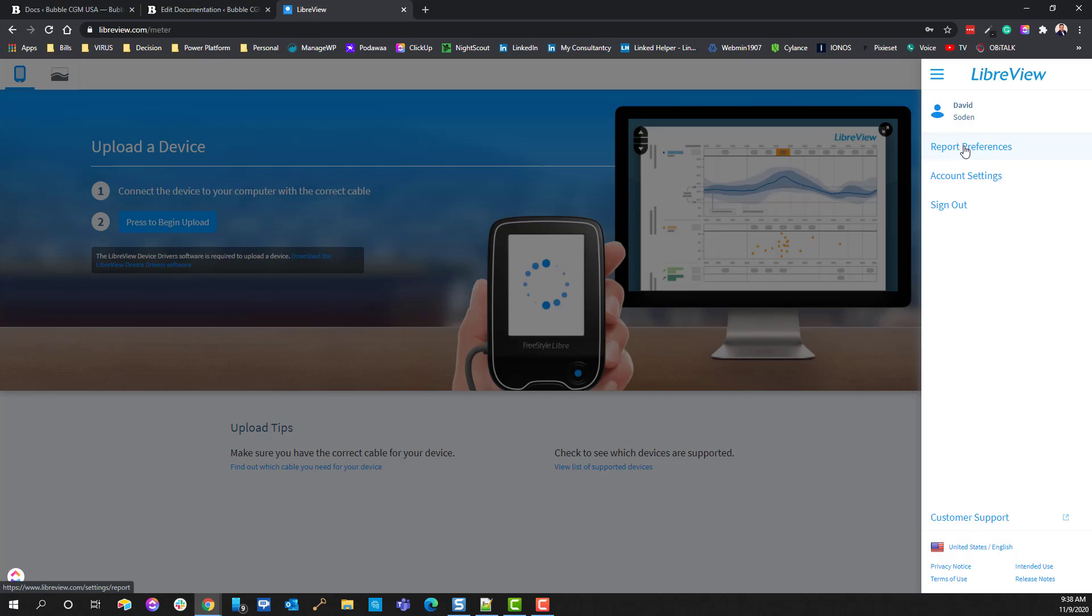So as of today's date, 11-9-2020, this is how the LibreView web-based software is.